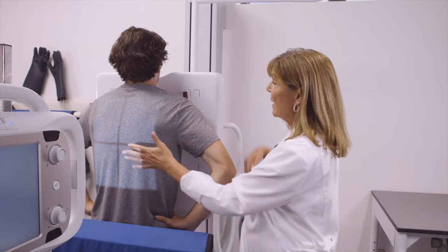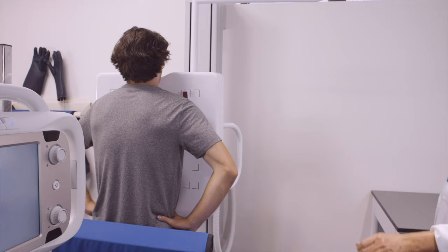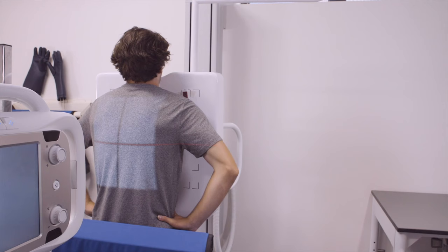I have a right marker on the right side, and as I step away I'm going to ask him to take in a big deep breath and blow your breath all the way out. Take another deep breath in, hold your breath, don't breathe, don't move — and the exposure is made.